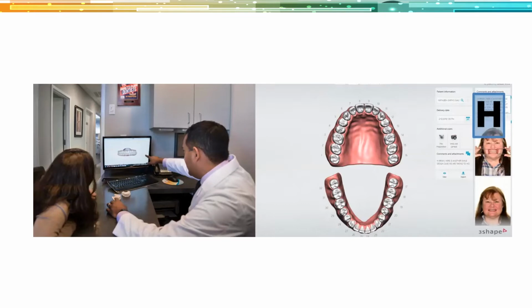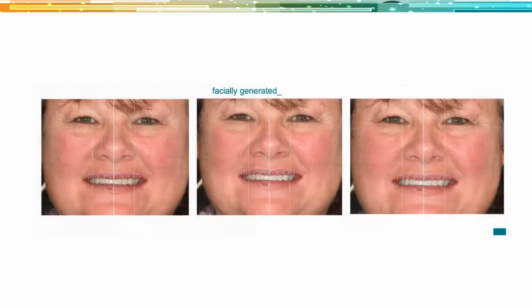And that's really one of the hows. So whenever you see an H on the upper right hand part of the screen, I'm going to show you some of my hows. And so once we have those two photos, and this really doesn't cost us any money. There's no lab expense. It's really just clicks and some time. And it's pretty quick as long as we're ready to get our photographs quickly, like we are.